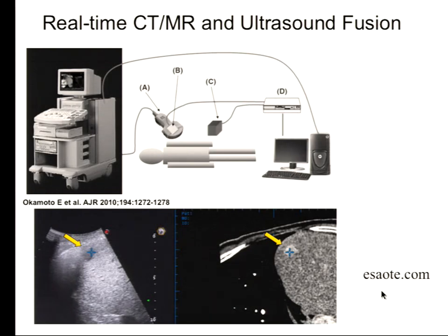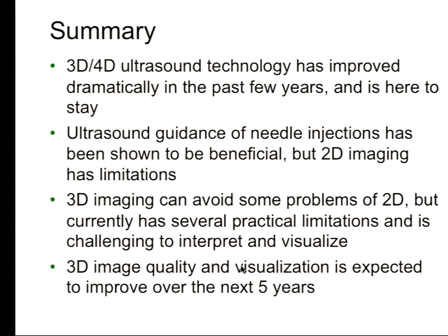The previous speaker mentioned fusion. This is, again, being researched. Some vendors provide the capability to do this. Fusing ultrasound with preoperative MR and CT images using these position sensors for registration. Again, I agree completely with the previous speaker's comment that this is probably going to be very cumbersome for routine use. So in summary, the technology has improved significantly over the past decade.